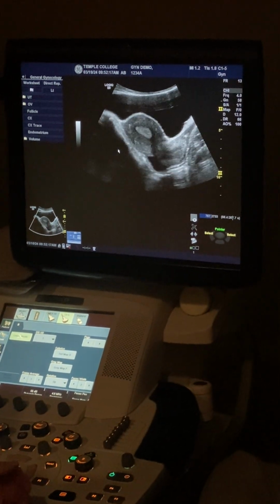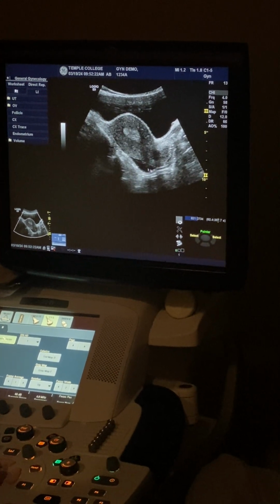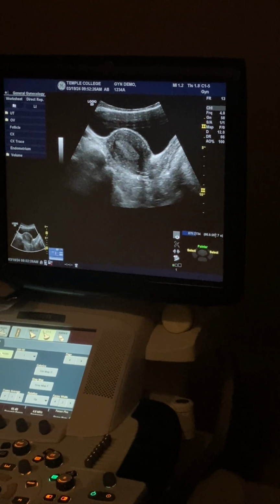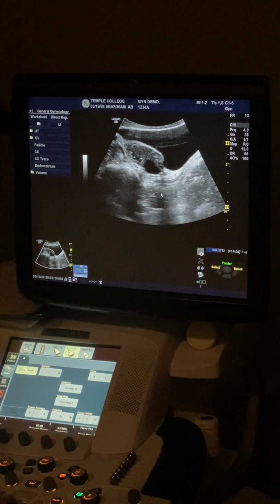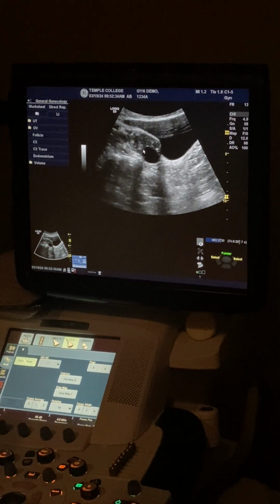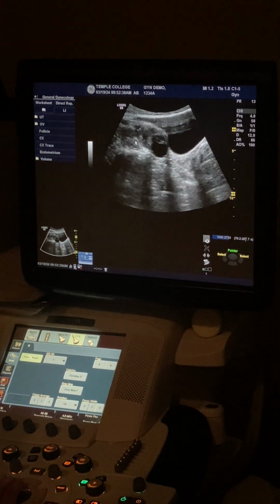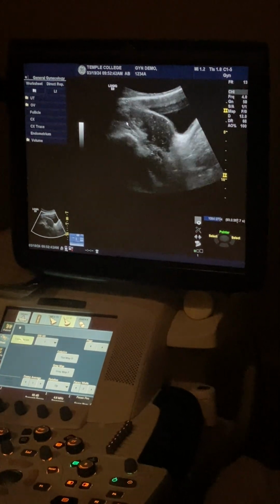So for her ovaries, this is another thing you can kind of tell that you're about to start your cycle. This little fluid bit down here from ovulating. Did you have ovulation pains recently? Little crampy bits? Okay, that's what that is. This is your dominant follicle. You're ovulating from that ovary. So, does everybody see her ovary? Yes. Right? All the ones that were with me, yes, finally, I see an ovary.